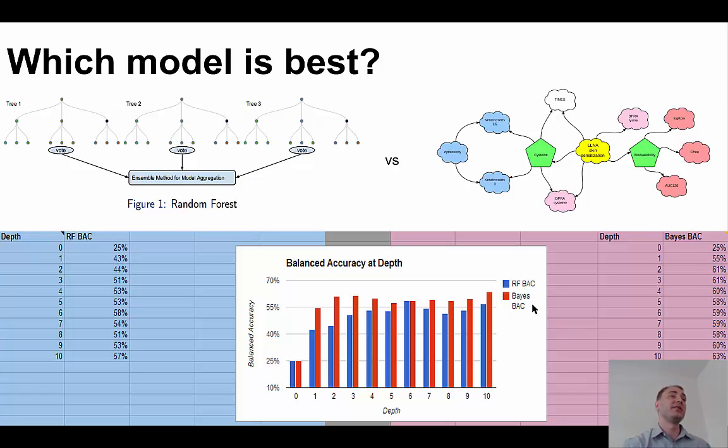I think that this model needs to be improved a little bit. Essentially what we would like to do is have good ideas of what the confidence level is at each point in testing, and we would like to be able to say how much improvement in accuracy we would expect to see for more testing. So that we would be able to create a well-defined cutoff for where to say you should no longer do any more testing.